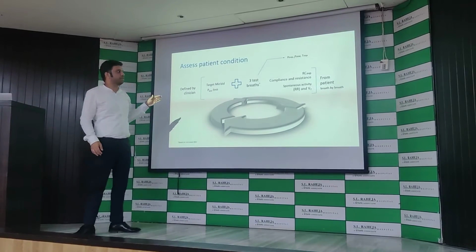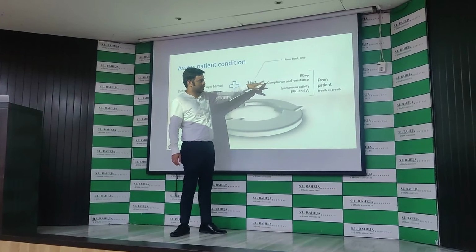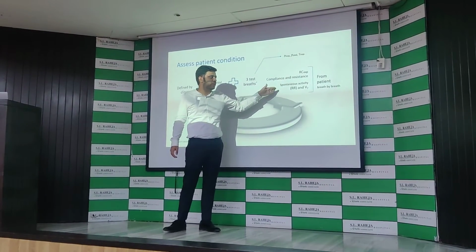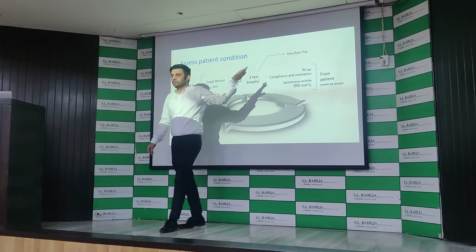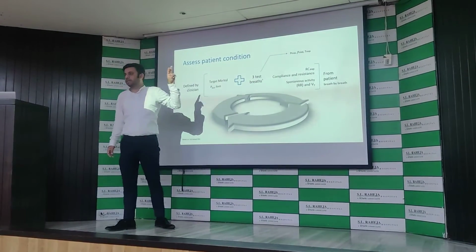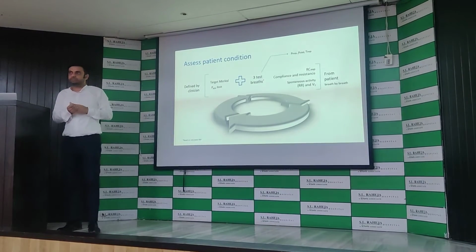Based on that, it will calculate the respiratory time constant with the compliance and resistance. It will also measure the patient's spontaneous activity by the RR and the volume. So this is from the patient part, breath by breath. But for that, when we attach, as I said, it is going to give 3 test breaths to achieve the best possible values. So this is a knowledge-based system.